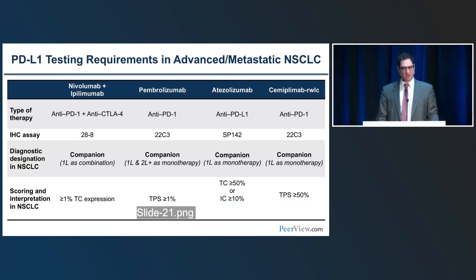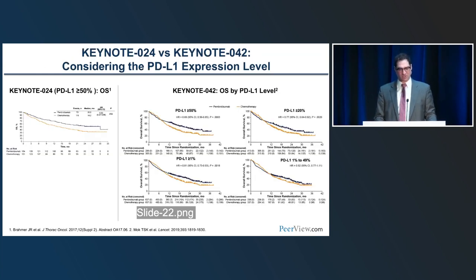And so in terms of PD-L1 testing requirements in advanced metastatic non-small cell lung cancer, many of you are familiar with the companion PD-L1 IHC assays that go with these respective immune checkpoint inhibitors. 22C3 and 28-8 have been shown to be comparably similar in results, and SP142 for atezolizumab with the Ventana TC IC assay.